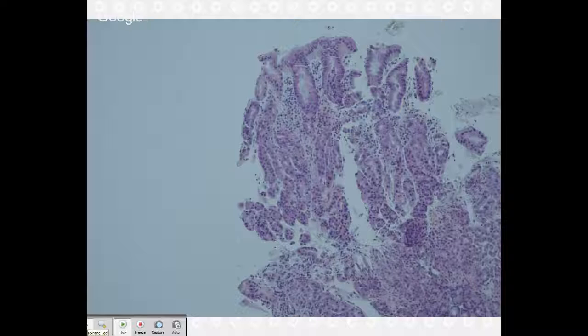So there's atypia, but it's not like malignant atypia. It's more reactive atypia. So that's what you're going to see in a taxane or a Taxol, and that's a chemotherapeutic agent. It's typically for ovarian, for lung. I think also sometimes for breast. I'm sure if I'm wrong, someone on YouTube will correct me.